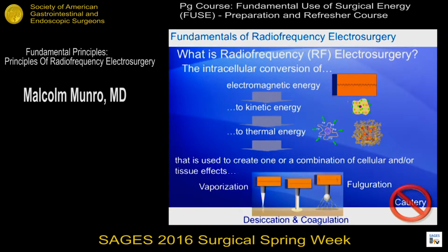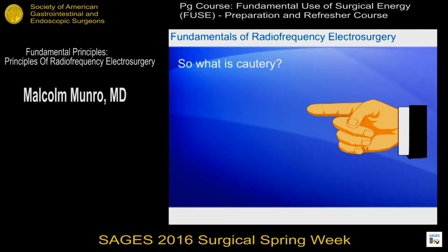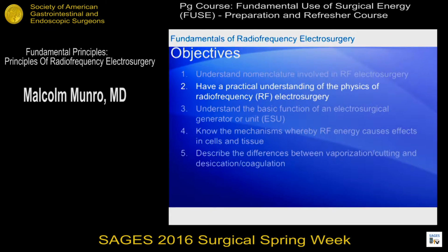So it's not cautery. You say, well, what is cautery? Well, cautery is the passive transfer of heat. So if you light a match and you burn your finger, that is cautery. Or if you work on a farm and you heat a branding iron and transfer that heat to the skin of your steer, that is cautery. But that's not what we're doing in the operating room.